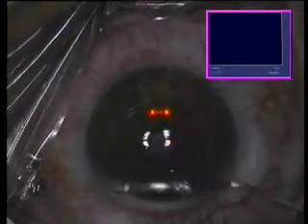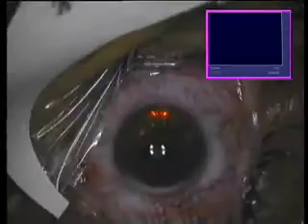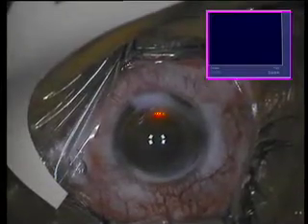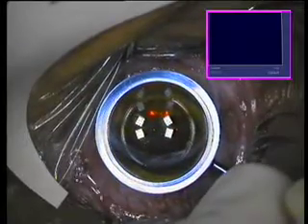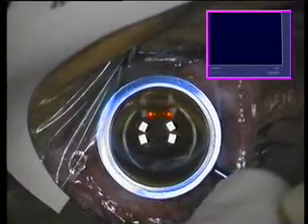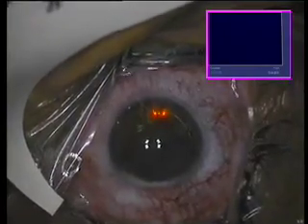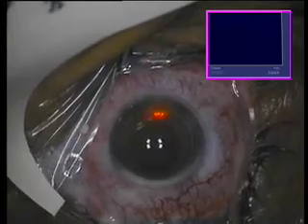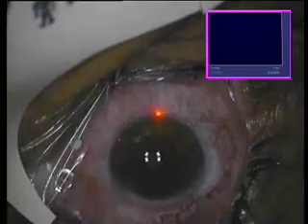The reason for using topography in this hyperope is our desire to center the ablation over the line of sight, and not the center of the pupil. We're using Pred Forte here to ascertain the gutter of the flap and make sure the flap is well centered. Using a Johnston applicator to iron out the center of the flap and make sure no microstria will be present postoperatively. One more drop of Pred Forte shows that our flap is sitting in the right position. You can see here clearly the gutter of the flap delineated with a drop of fluorescein.